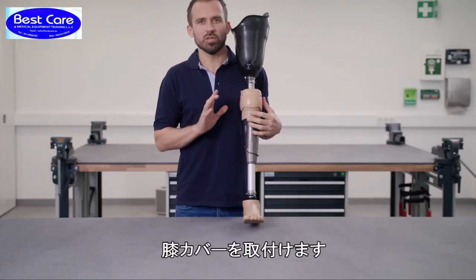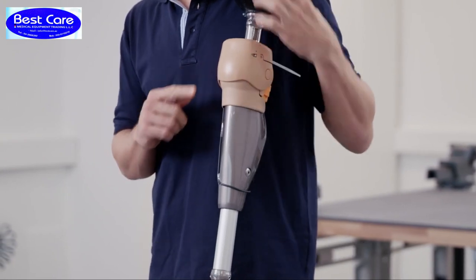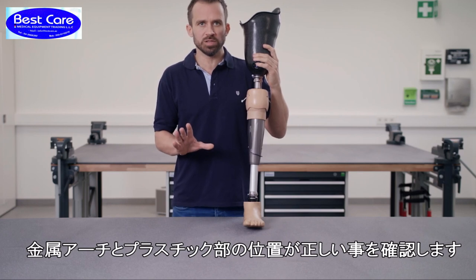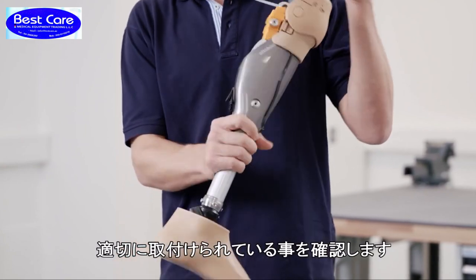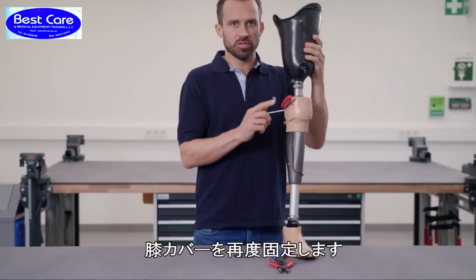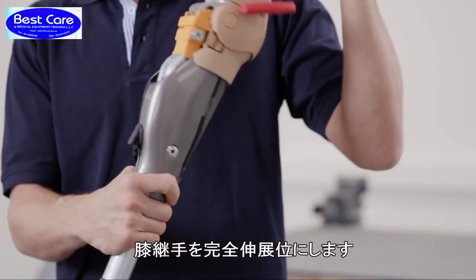Now install the functional knee part. Loosen any screws which have been pre-tightened. Once again check that the metal bracket and plastic part are properly positioned, and make sure that the functional knee part is fitted correctly on the frame of the knee joint. Secure the functional knee part again. Now bring the knee back to maximum extension.